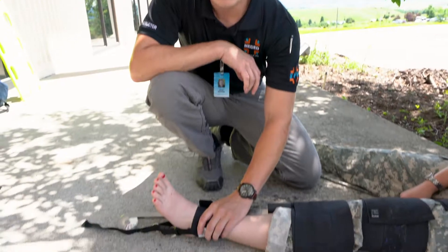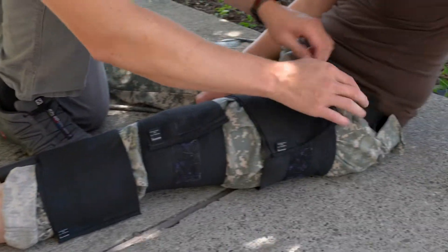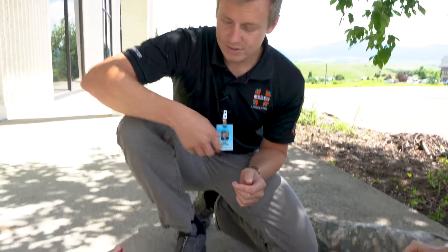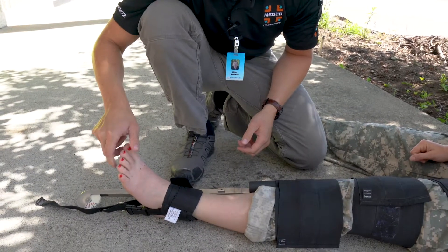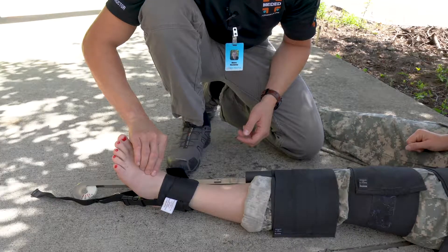Now that the splint has been fully applied, reassess the ankle hitch to make sure it's securely attached, and reassess the ischial strap to make sure it's correctly placed and still firmly centered. Reassess the patient's circulation, motion, and sensation. Katie, what toe am I touching? Big toe. Can you wiggle them for me? Pedal pulse is intact.